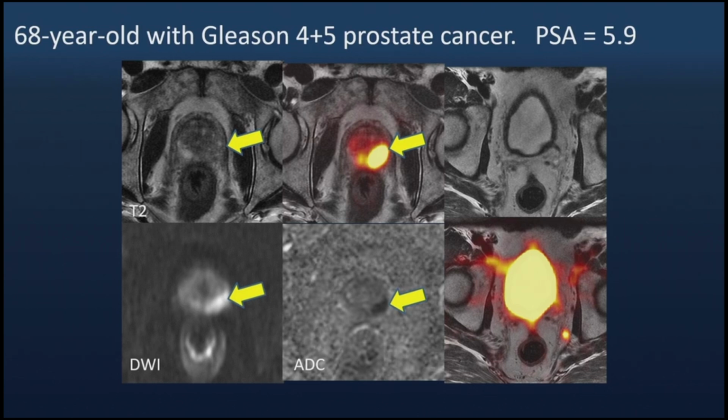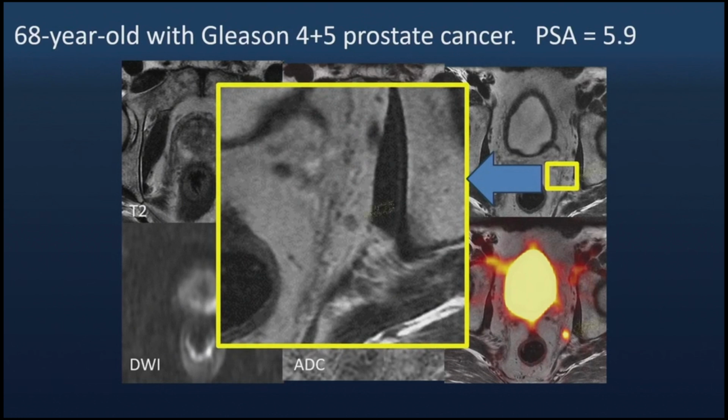To really see that on the MR, you have to blow it up, and that's the tiny little lymph node. It's about 3 to 4 millimeters. As an abdominal imager, I would probably, on a good day, maybe say indeterminate. A lot of times, it's probably just a benign lymph node. So it really helps us from detection.